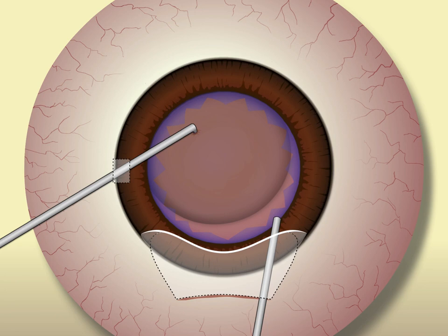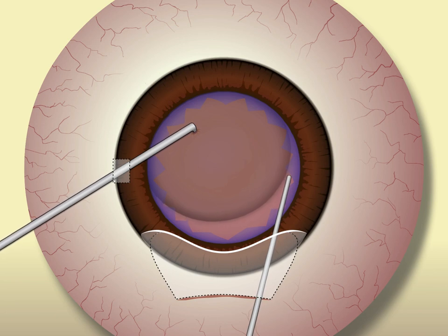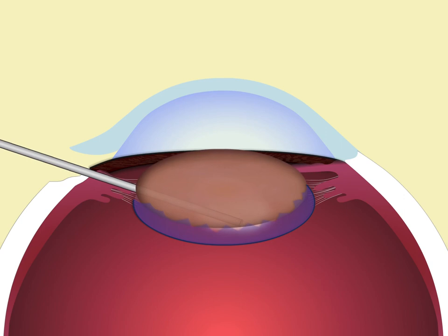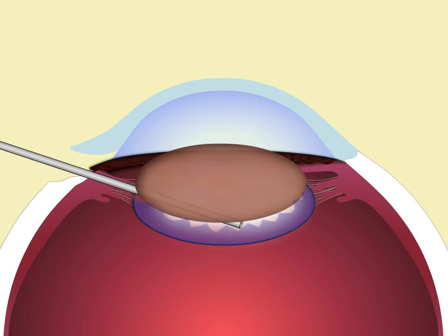At the same time, gently depress the edge of the incision and the edge of the capsulotomy with the edge of the OVD cannula. This will shallow the anterior chamber slightly, and the nucleus will rise up even higher. Then slip the edge of the cannula under the nucleus and inject a little OVD. Once you've created a space between the nucleus and the posterior capsule, slide the OVD cannula under the nucleus, inject more OVD, and lift the nucleus out of the capsular bag.